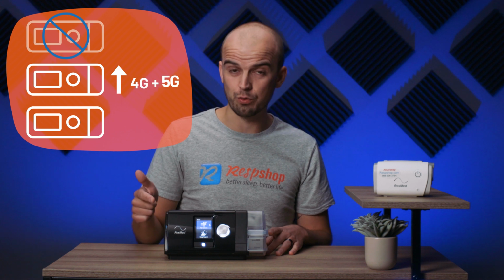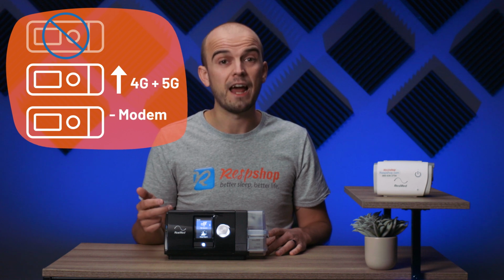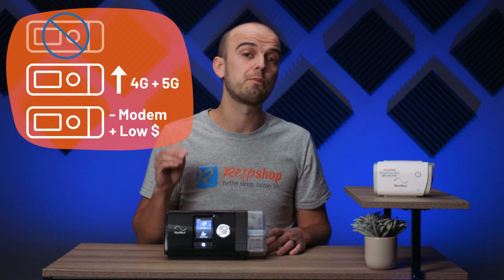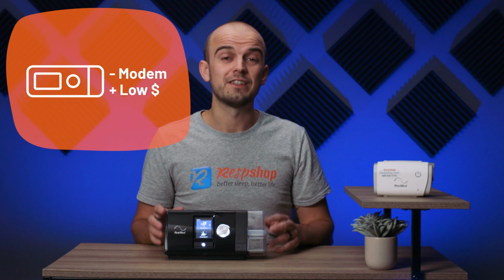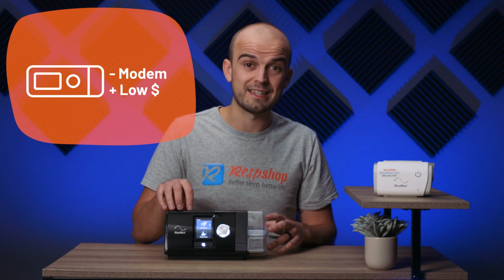This has meant the modem has been useless in the older models anyway, so ResMed could either discontinue the still highly popular model, upgrade the modem to one that works on 4G and 5G networks, or simply continue to make them but without including the redundant modem and offer them to consumers at a lower price. And that's the option that they went for. And the second reason for releasing this model partly explains their decision.